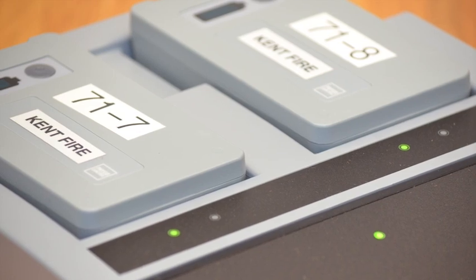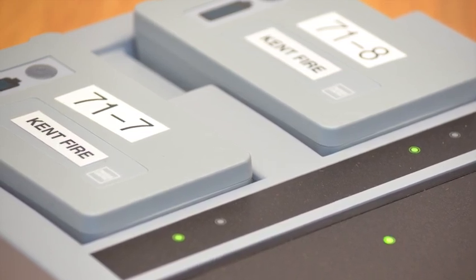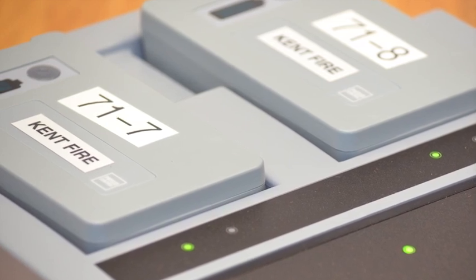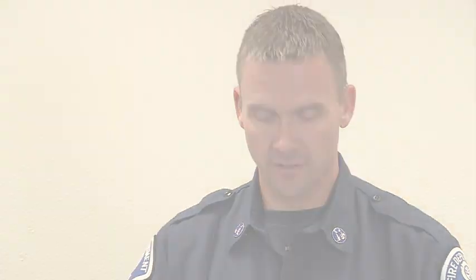One of the things Physio Control talks to us in the literature about is that 2 newly fully charged lithium-ion batteries for LIFEPAK 15 will give us a continuous running time, monitoring running time of 360 minutes, or allow us to deliver a 360 joule shock 420 times. So this should alleviate any angst for those of you who are out there worried about onboard charging systems and having enough battery power for the LIFEPAK itself, which also drives home the need for us to do a good rig check in the morning and ensure that those batteries are fully charged.